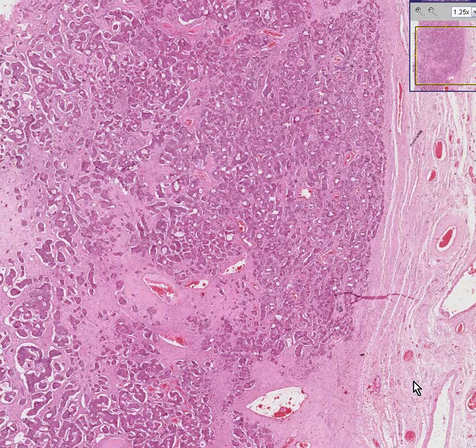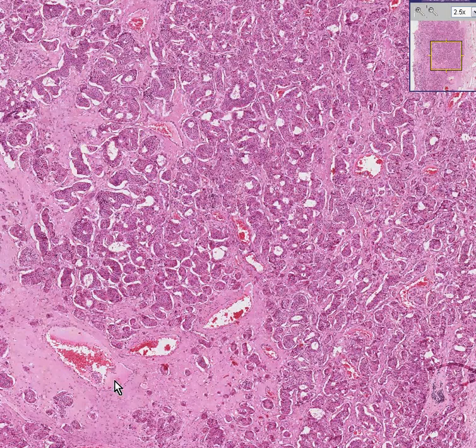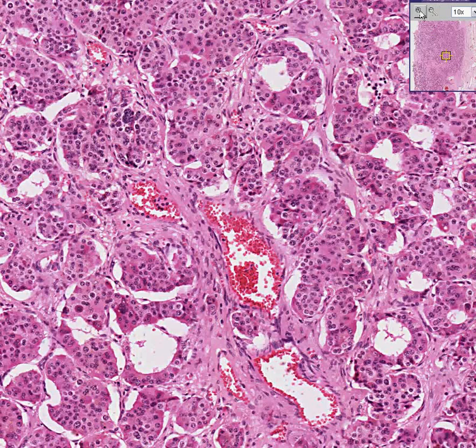Here is another testis. You can see the capsule. And rather than having nice, well-formed tubules with a little bit of stroma in between, you see that some of these tubular-like structures are proliferating. In some areas, they have a lot of stroma in between. But notice, these cells in tubules or glands or whatever you want to call them — they don't look like they're making sperm anymore, do they?